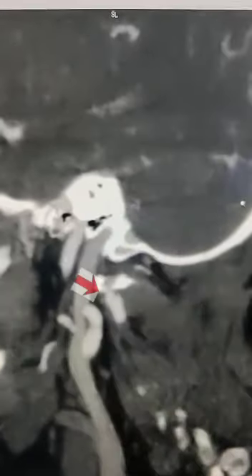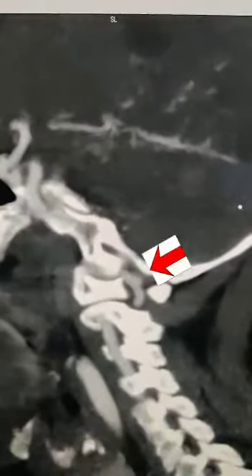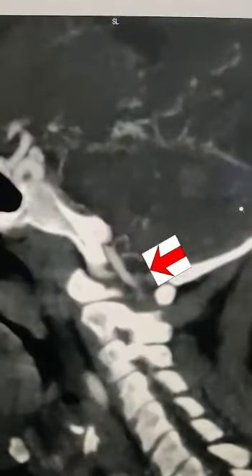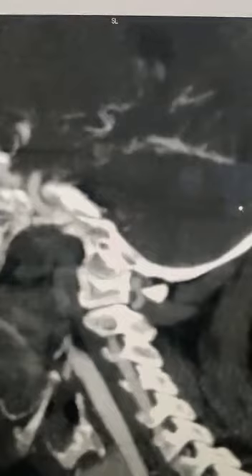Review of the CT angiography clearly shows the proximal stump and the distal stump and we could come to a conclusion that this occlusion of the fenestrated vertebral artery limb was the cause for the stroke.